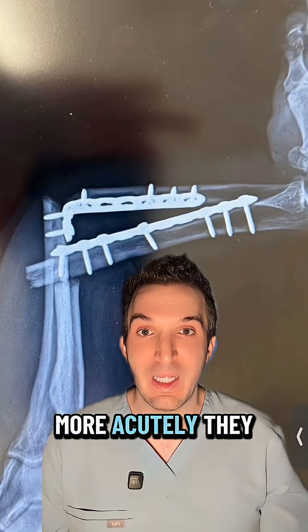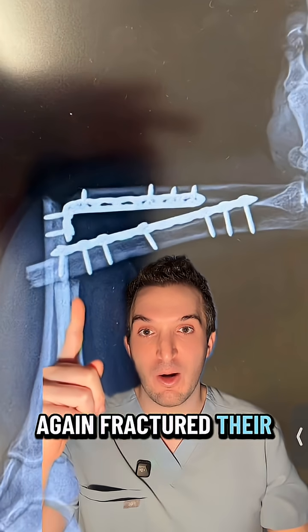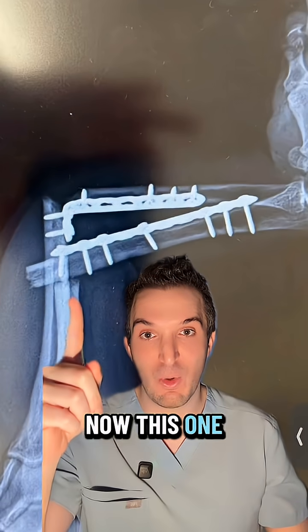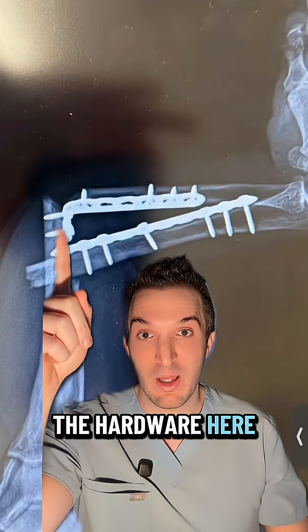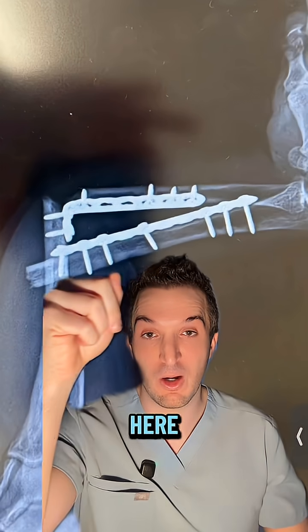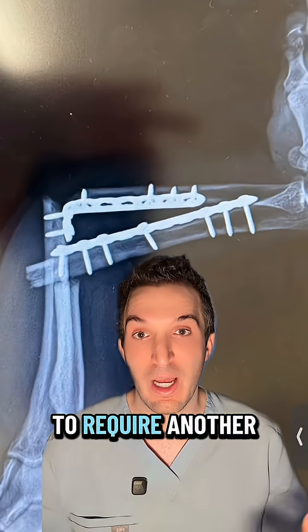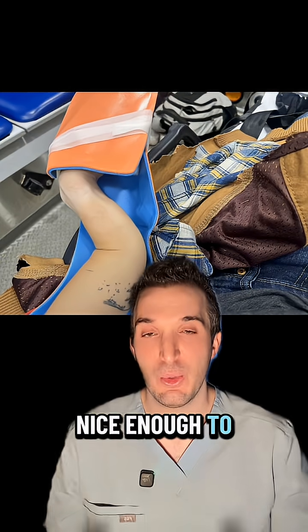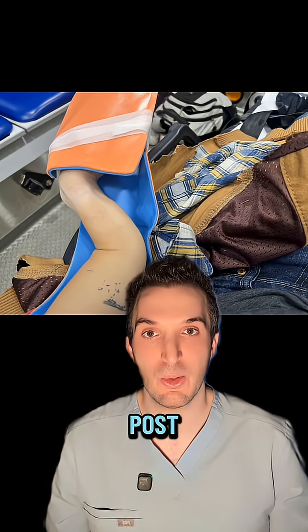However, more acutely, they again fractured their radius and ulna at different positions. Now, this one did not involve the hardware here. This one has bent the hardware here. This is going to require another surgery with more hardware implanted. The individual was nice enough to include this picture on their Reddit post.